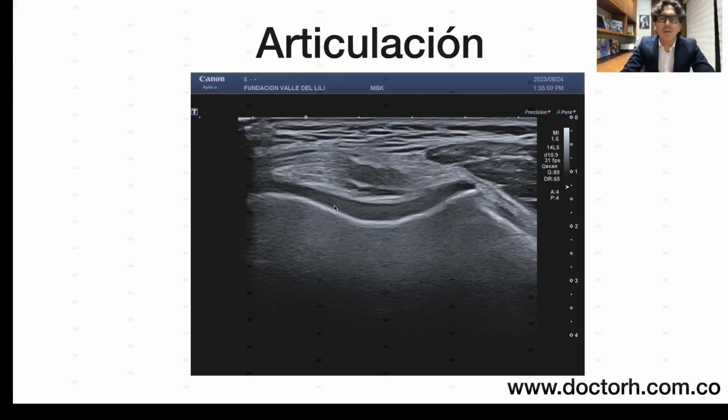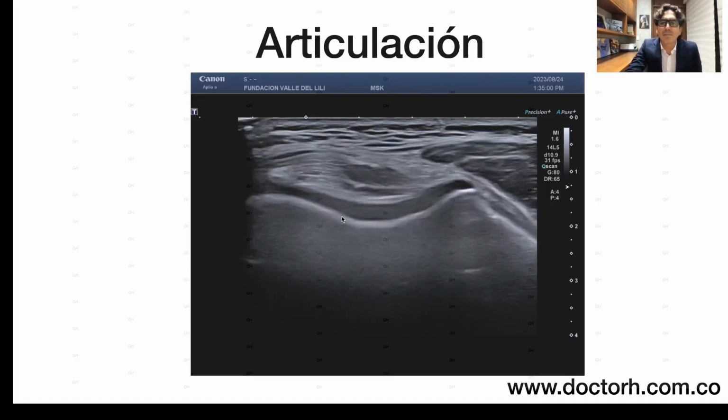This is a trochlea where, clearly, if we already identify a hyperechoic pattern that corresponds to the trochlear bone, with posterior acoustic shadowing, the cartilage, due to its high liquid content, will appear as an anechoic image. There are different structures that we already recognize above, but basically, in all joints, we are going to identify bone and cartilage.